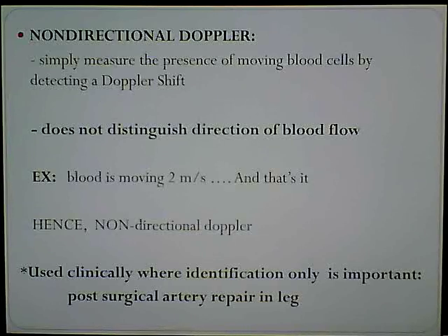It's used clinically where identification only is important. For example, you have a post-surgical artery repair in a leg. Well, the doctor just wants to know if there's flow getting down there. He knows which way it's going. He just wants to know if it's there. It's not as important as if you're opening up a pathway. Say they have a blockage, or they get in a car wreck and the artery's severed and he repairs it. He knows it's going to go the right direction. He just wants to know if you hear it down by the foot, if he repaired it in the thigh. Heart patients, anything like that, they want to know that just the blood flow is there.